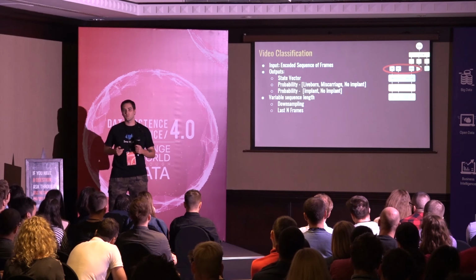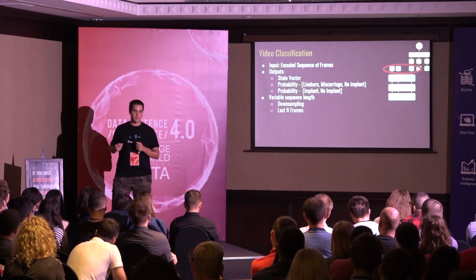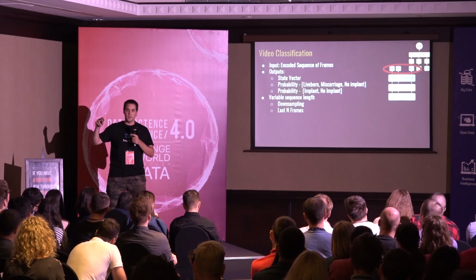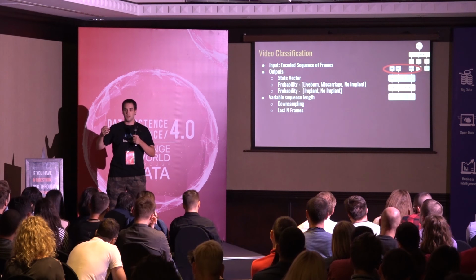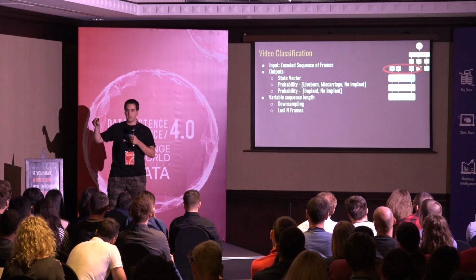So we decided to do some downsampling. By that, I mean we took all frames from the video and divided those frames into, for example, 100 groups.